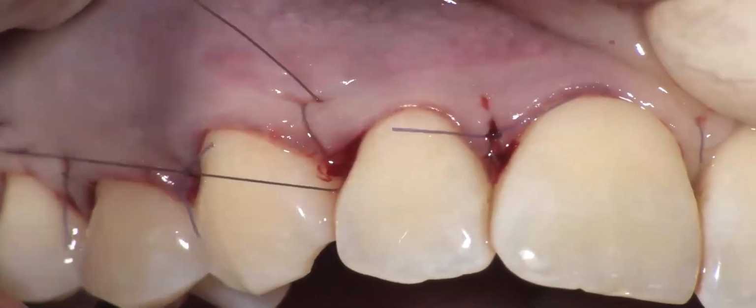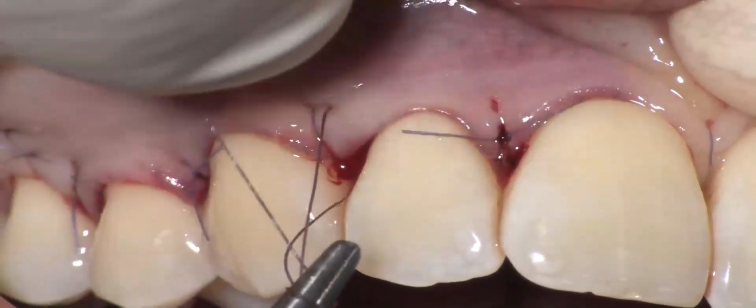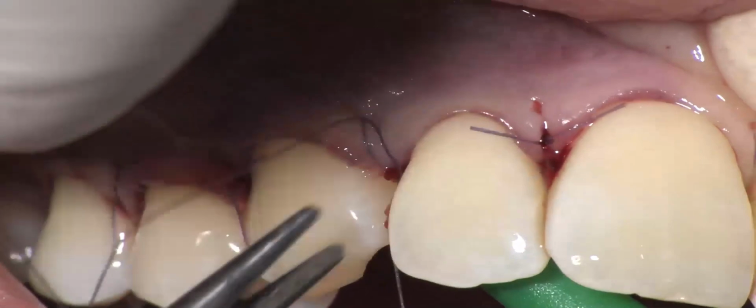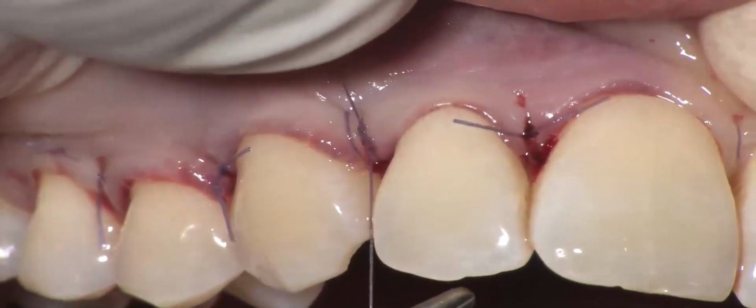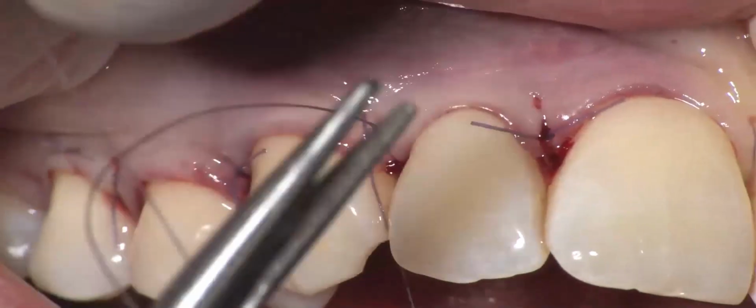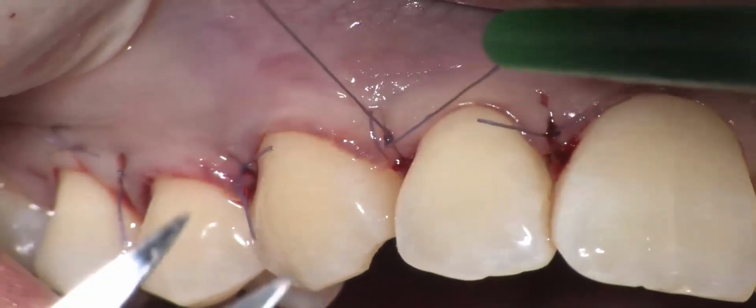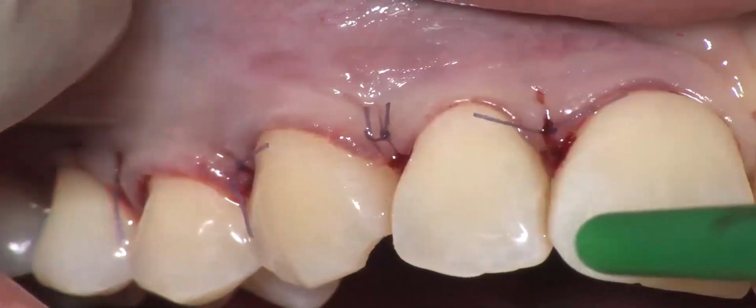And now I close and give good adaptation of the papilla also between the lateral and the central and improve the ischemia of the keratinized tissue around the canine.